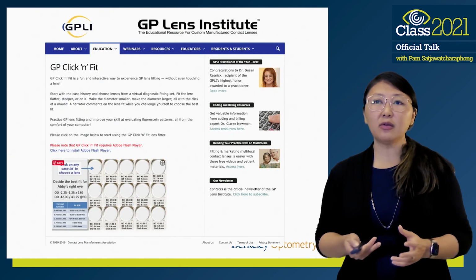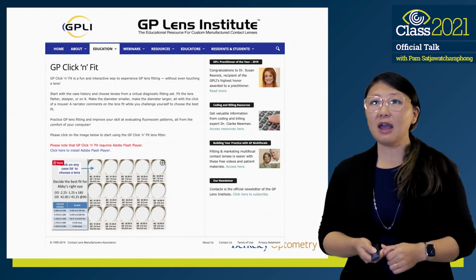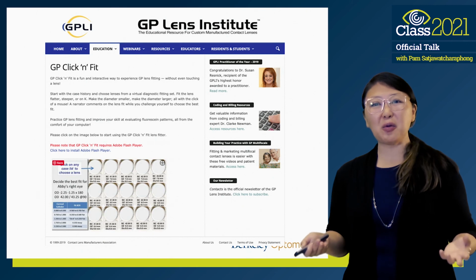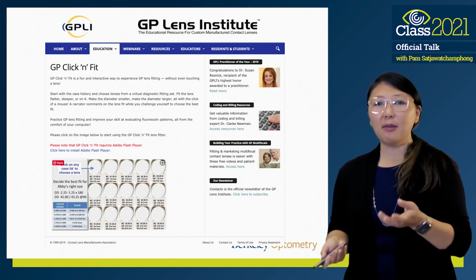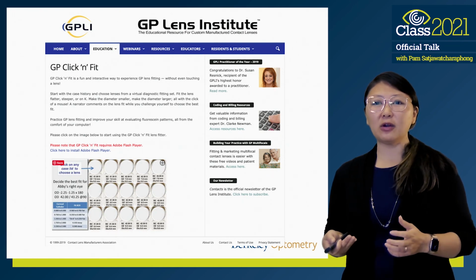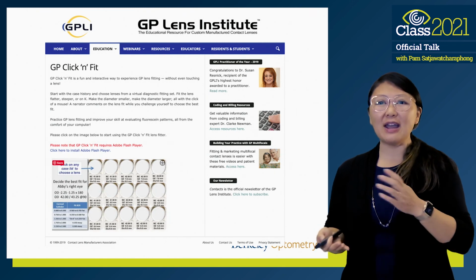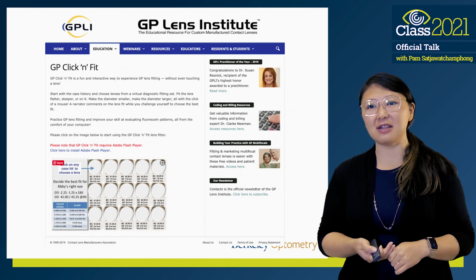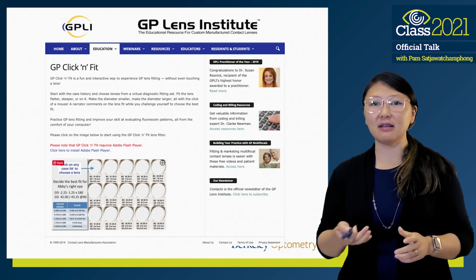So here are a couple of resources that you guys can access via the internet. The Gas Permeable Lens Institute is a really great resource, not only for corneal GPs, but a whole host of other specialty lenses. I find this tool, the GP Click and Fit, a fun way for you to engage with a case and try out different lenses from this fitting set to see how it looks on this patient. So this is something that you guys can access anywhere in the world.